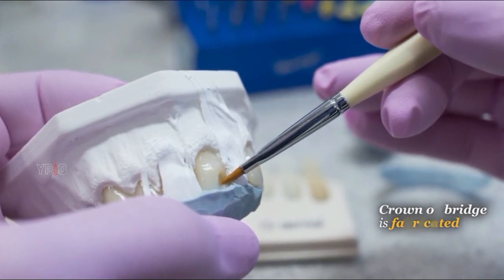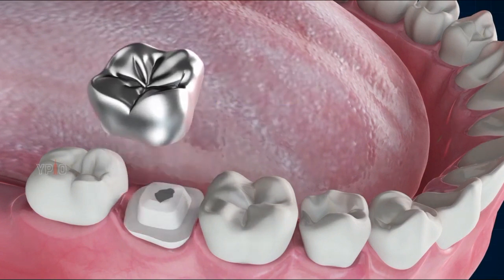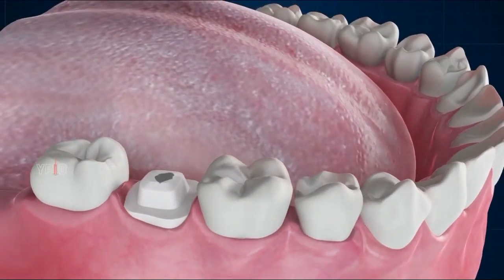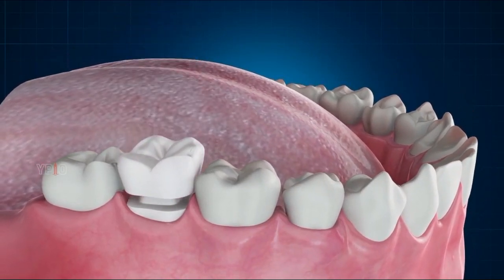While your permanent restoration is being made, your doctor will place a temporary crown or bridge of acrylic or stainless steel over the prepared teeth. When the permanent crown or bridge is ready, your dentist will remove the temporary one and evaluate the fit and shade of the permanent restoration. If all is acceptable, the crown or bridge is permanently fixed with cement.